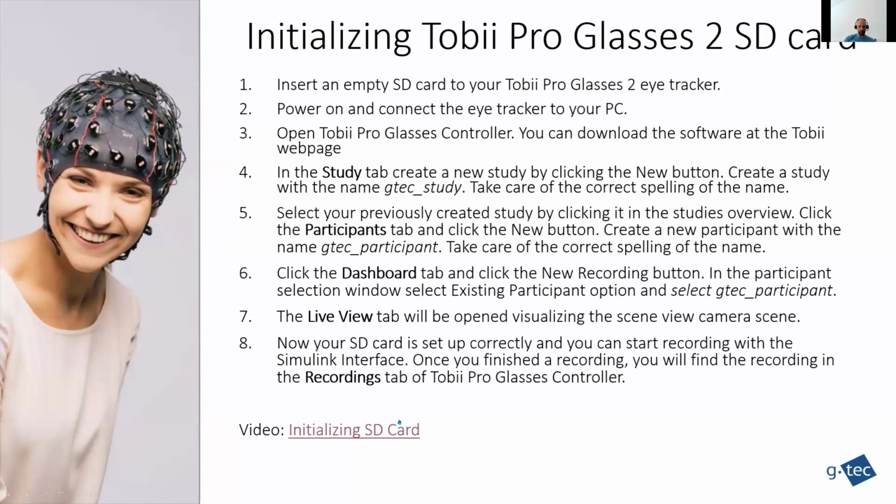I also want to show you a video of how this initialization of the SD card is done.